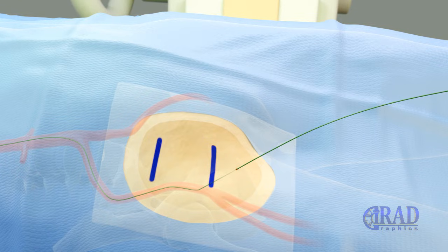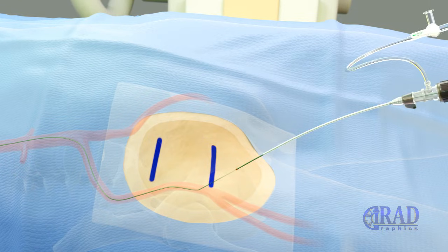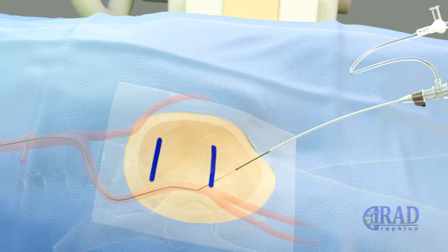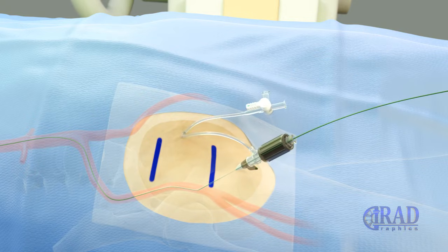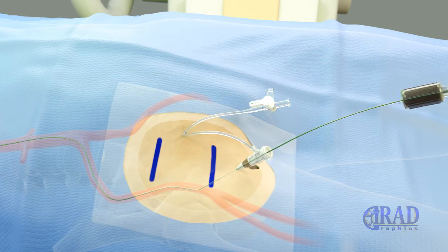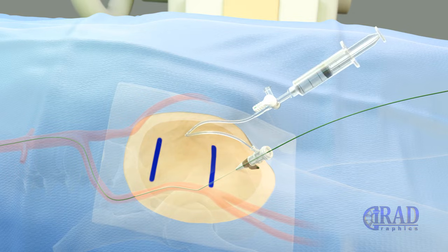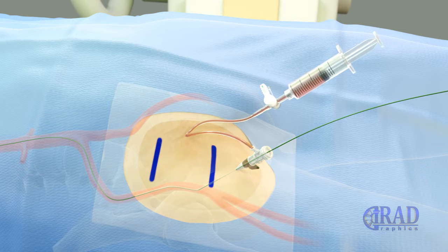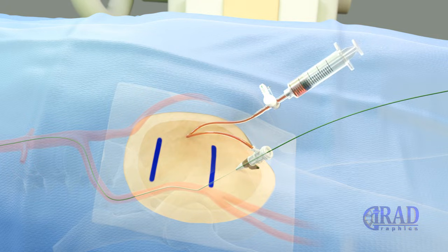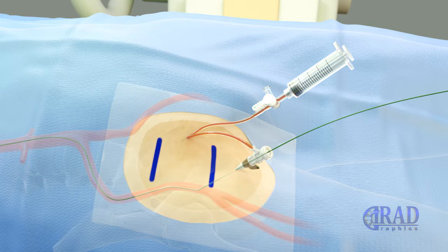Then, the outer layer of the transitional sheath is exchanged for a vascular sheath, and the dilator of the vascular sheath is removed. At this point, the sheath is aspirated and flushed with heparinized normal saline. Contrast may be injected to assess the patency of the common femoral artery and safety of the access.